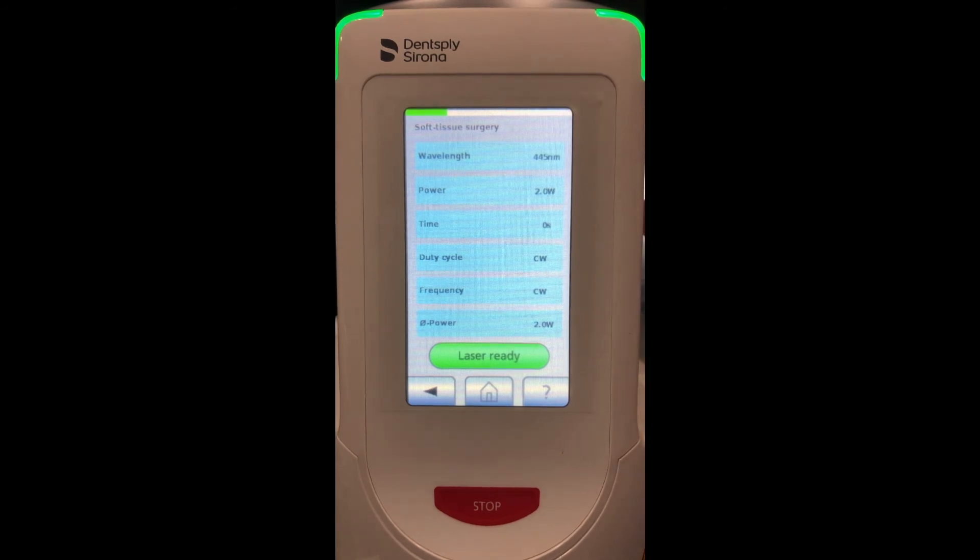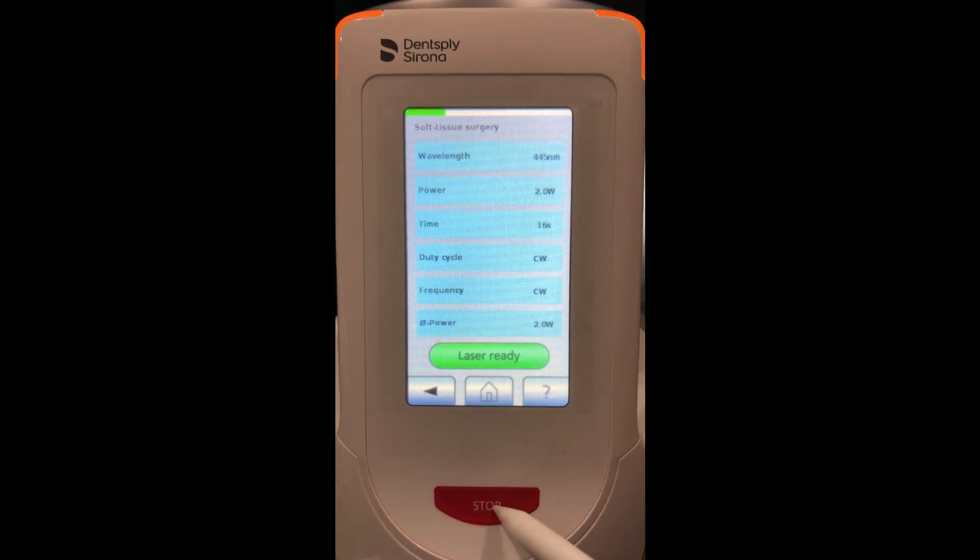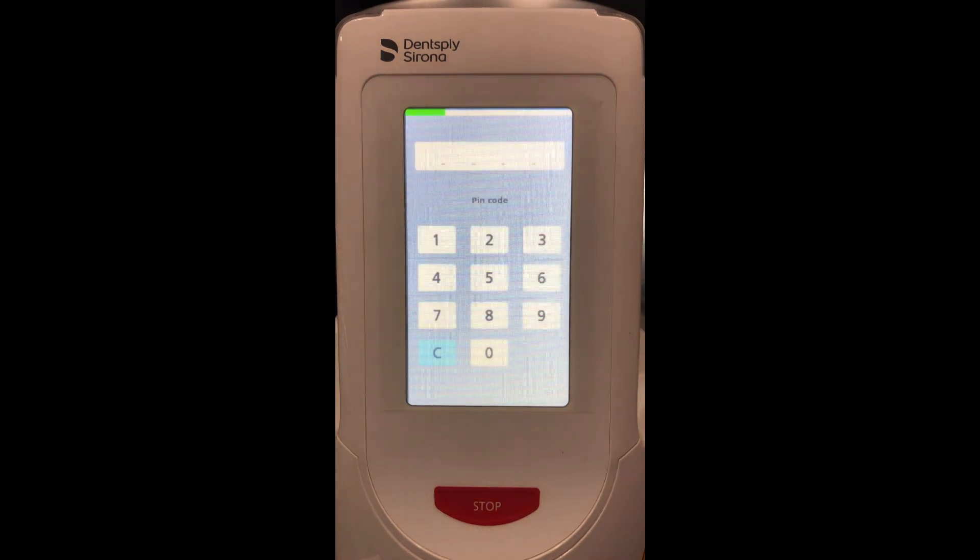When we actually fire the laser, notice the lights on top of the laser start to flash orange, letting everyone know that the laser is being fired and active. The 'laser ready' indicator also switches to yellow with the yellow triangle, and we will hear the beeping. When the procedure is complete we hit stop at the bottom; on screen it will show 'laser stop,' and now we will have to put our pin code back in to return to the screen.